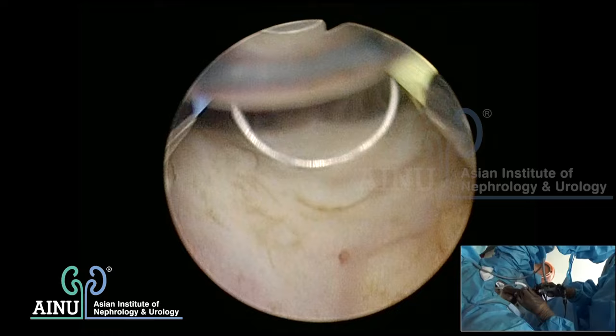The sphincter area is preserved - this is the sphincter area with the liso sphincter, a smooth muscle sphincter, covered very well. I'm resecting the area near the apex from top to bottom. Debulking of the whole gland has happened and this is the apical area being debulked.